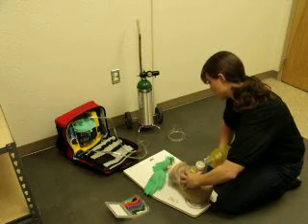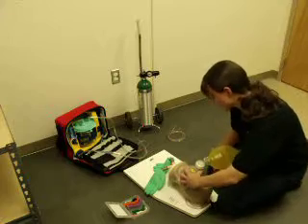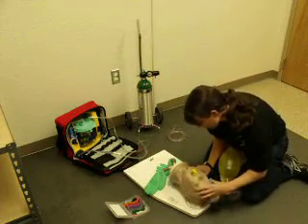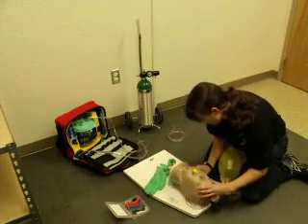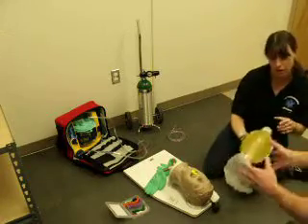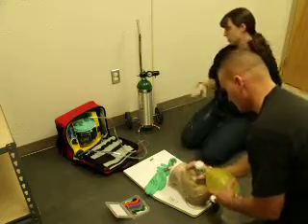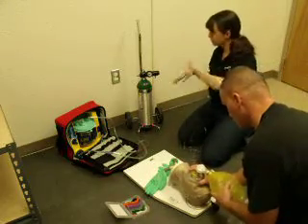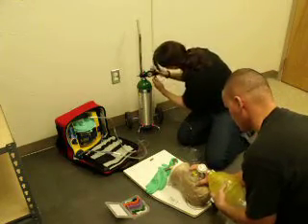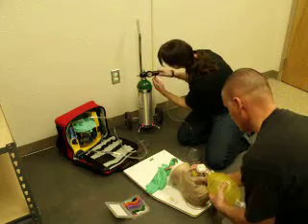You get good bag compliance. It's been thirty seconds. I'm going to check for a pulse again. You palpate a weak carotid pulse at a rate of 60. I'm going to have my partner go ahead and ventilate the patient while I hook up the oxygen — setting it at 15 liters, high-flow O2.